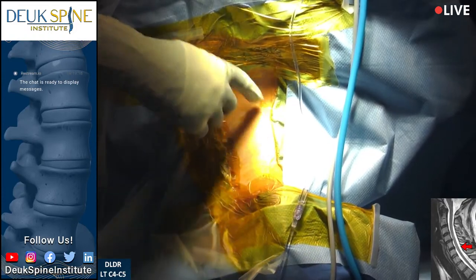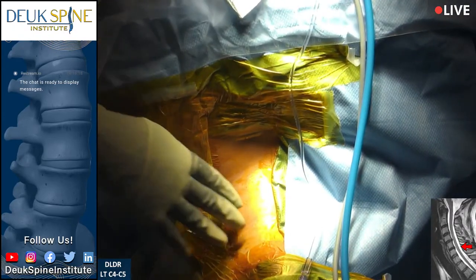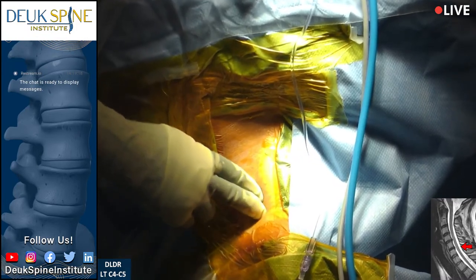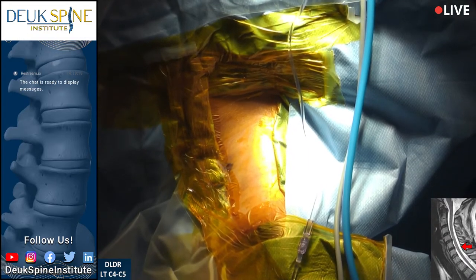This is the neck, her chest is here, and the rest of the body is down this way. I'm going to start by placing a needle into — we're going to start by giving our patient a little more muscle relaxation and putting her to sleep a little deeper.